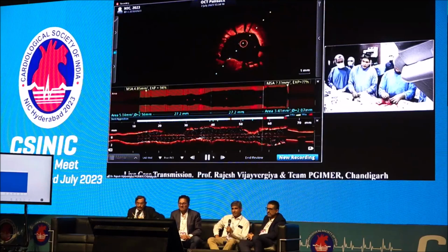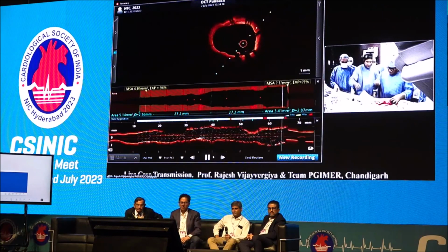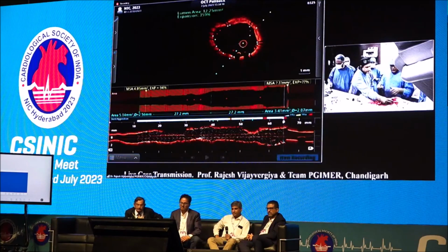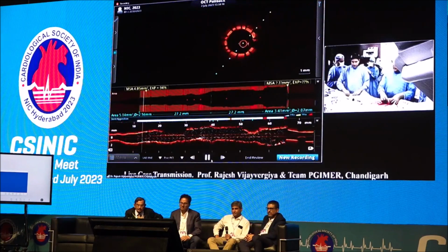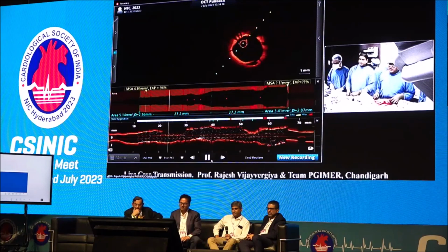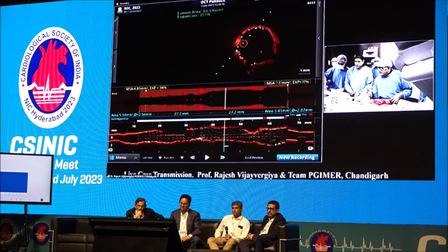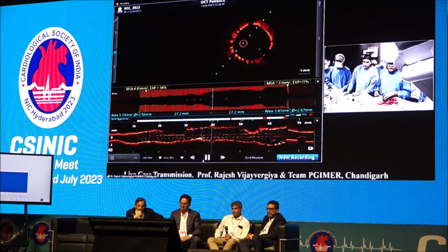So even after balloon dilatation with a 3 millimeter drug-eluting balloon, we didn't have an acceptable result across the ostial LCX, and therefore decided to go ahead and do the TAP stenting. We didn't do the kissing balloon at this moment before doing the OCT, so we put a 3.5 by 18 millimeter stent across the ostial LCX as a TAP technique. Then a 4 millimeter balloon, as the size of the ostial to proximal LAD is around 3.87, and this is the result we have.